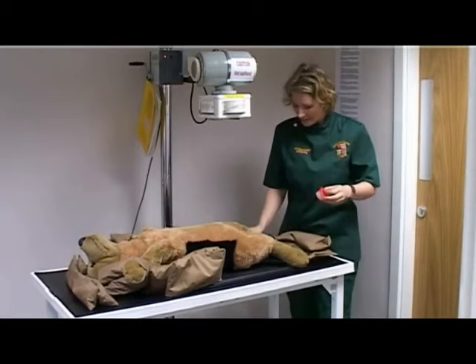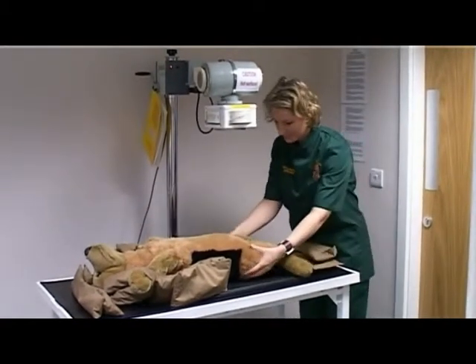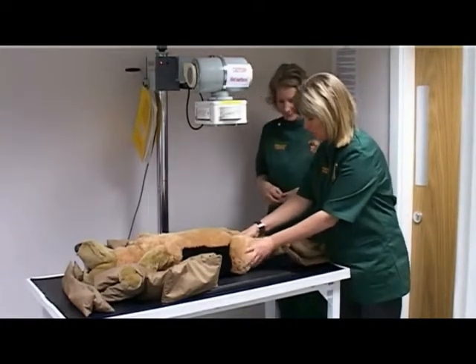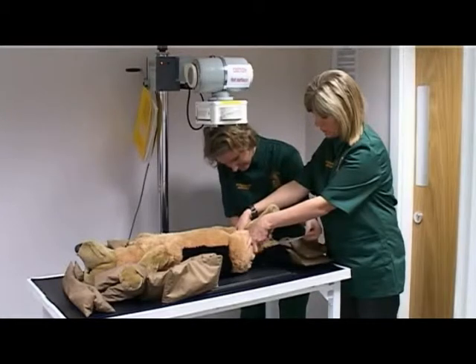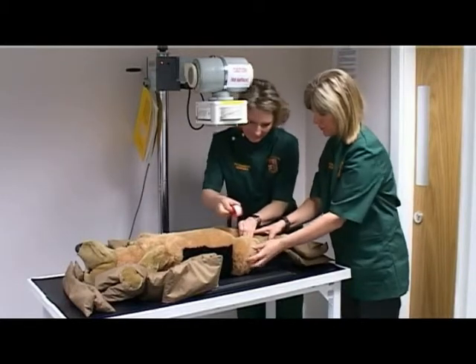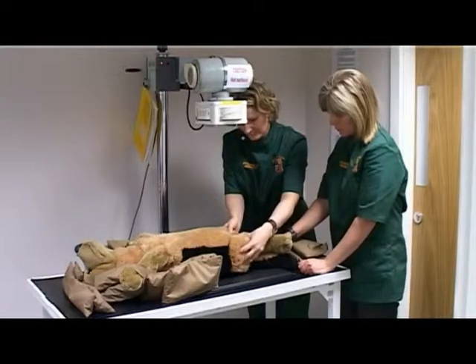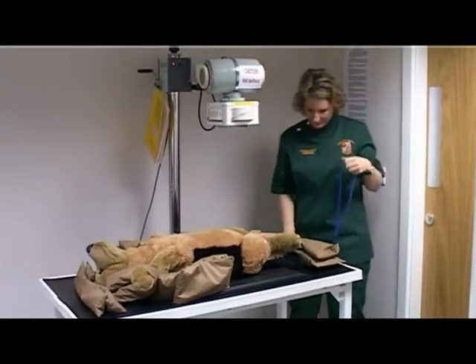Ask for assistance: would you be able to assist me in tying the dog's legs please? Medially rotate the hind limbs to bring the femora parallel to each other with the patella facing up towards the ceiling. Take the limbs into position and secure each hind limb caudally using sandbags or ties.